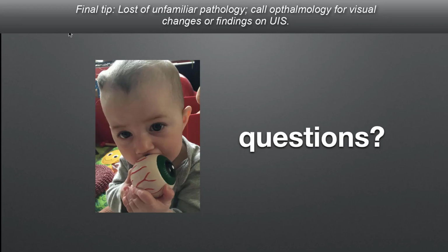Interestingly, there's lots of pathology in the eye that we never learned about in medical school. So if you do find something that's weird, go ahead and grab a couple clips of it, and then feel free to call your ophthalmologist, who is your consultant. A lot of them do ultrasound, and I have described findings on the phone, and they have given me the identification of the diagnosis when I've done so. So they're pretty good.